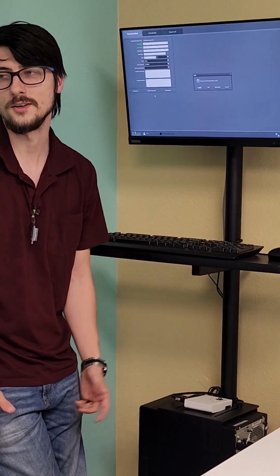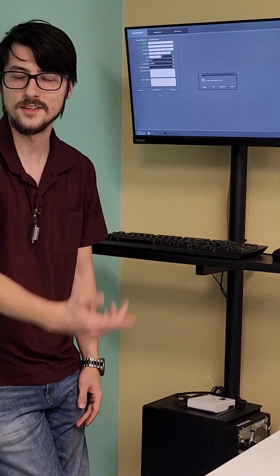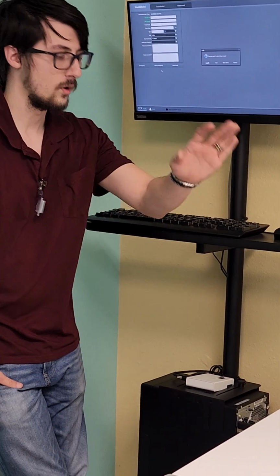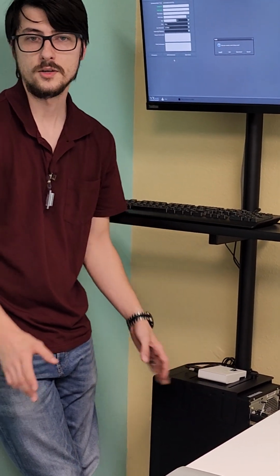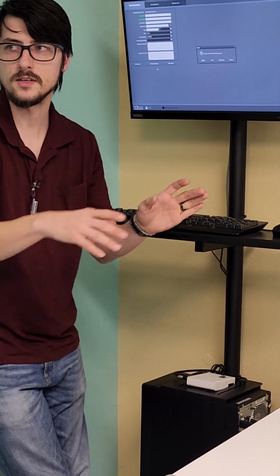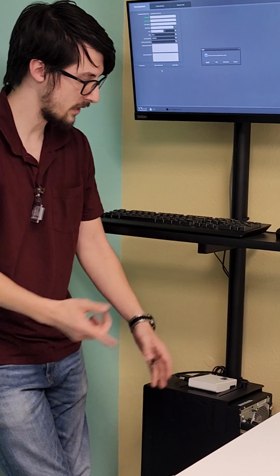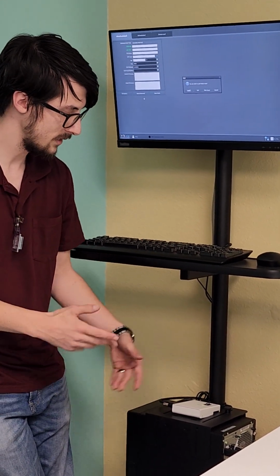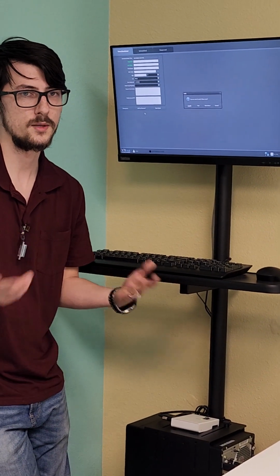They're like, oh no. Okay, well, turn that on for me. So just do everything through the computer if at all possible. It won't shut this off, so your panel will stay on, but just leave it alone. It won't communicate with anything, so it'll go to sleep and stuff like that. It has external power. It gets power from this thing, so it doesn't really need to be shut off.